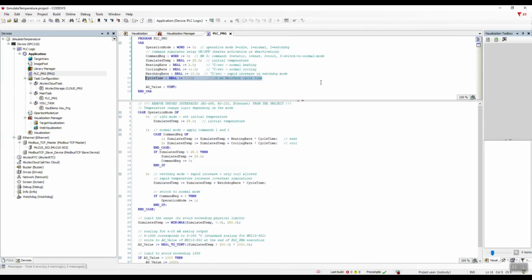Main task interval, expressed in seconds, that is, 0.01 corresponds to 10 milliseconds. Analog output control signal. With this, we convert the simulated temperature into a current in the range from 4 to 20 milliamps, where the lower limit of 4 milliamps corresponds to 0 degrees Celsius, and the upper limit of 20 milliamps corresponds to 200 degrees Celsius.